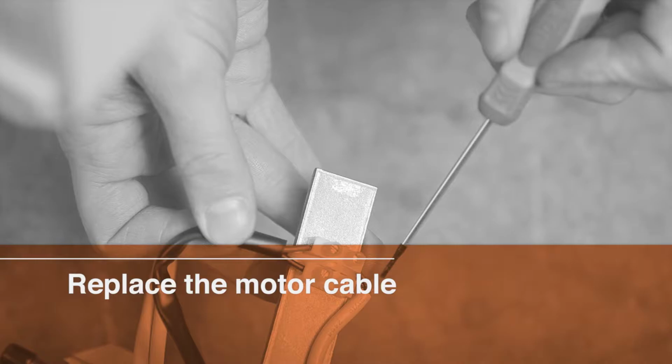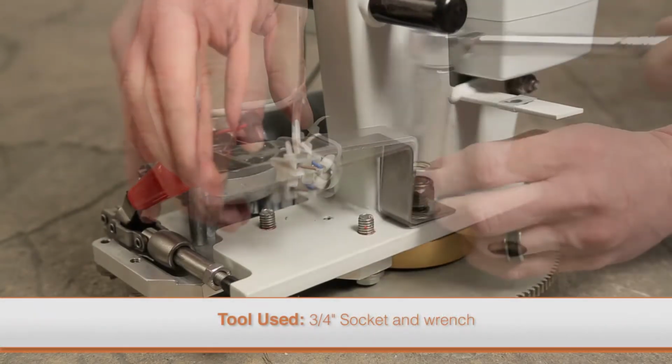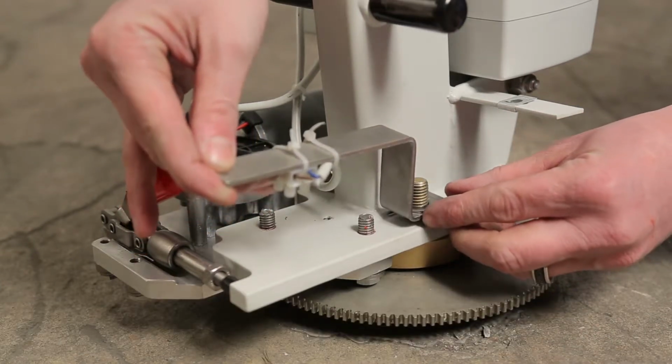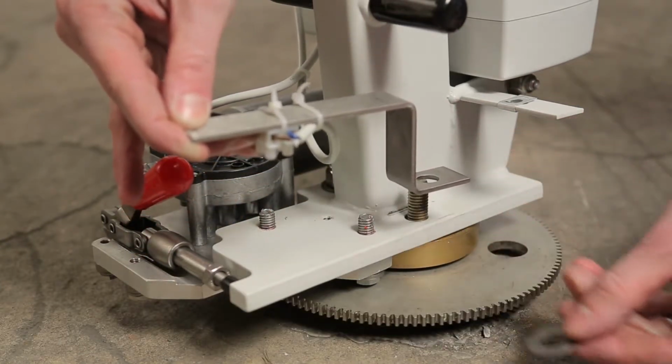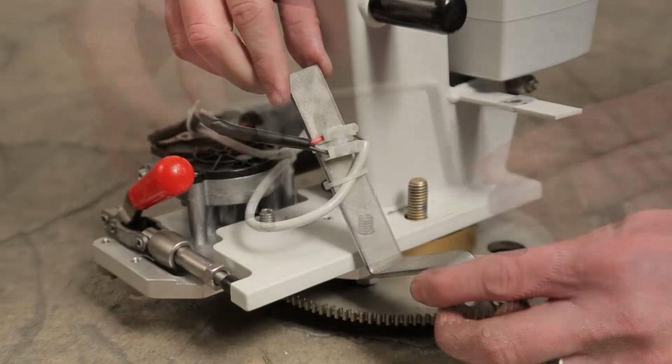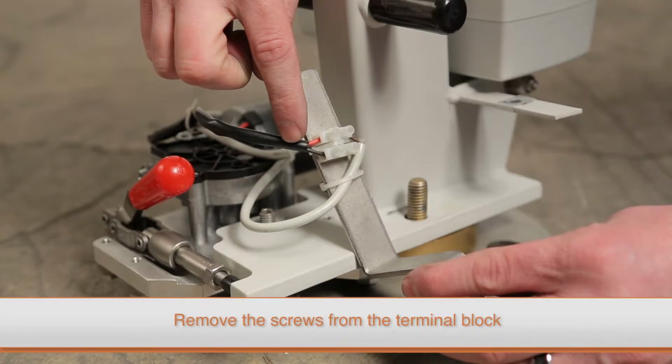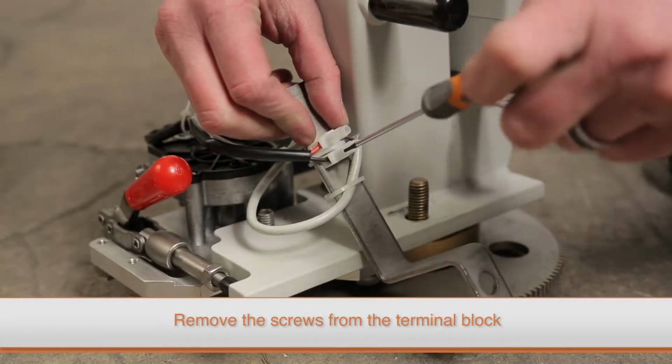To replace the motor cable, you must first detach the support bracket that secures the terminal block to the lift using a socket wrench. Gently lift the support bracket to gain access to the terminal block. To replace the motor cable, loosen the two screws in the terminal block with a small flat blade screwdriver. Then remove the cable end.